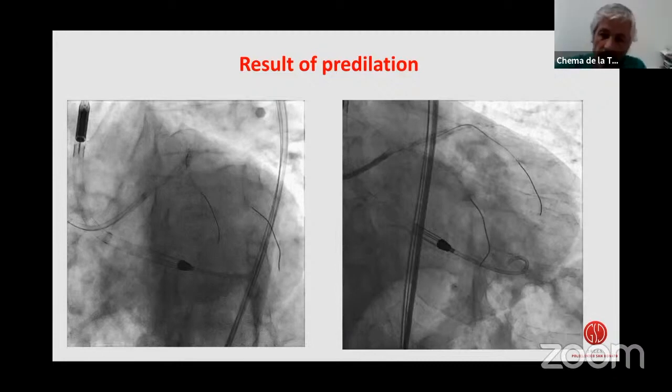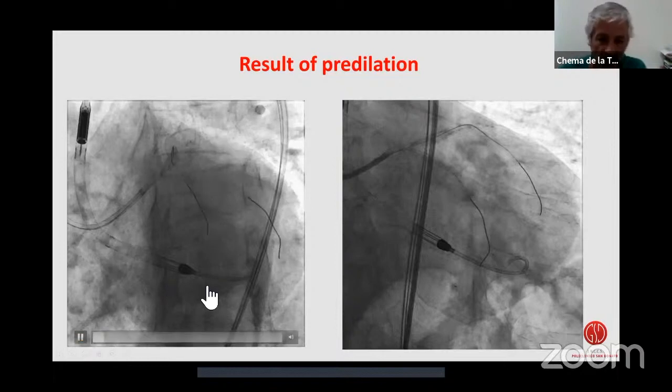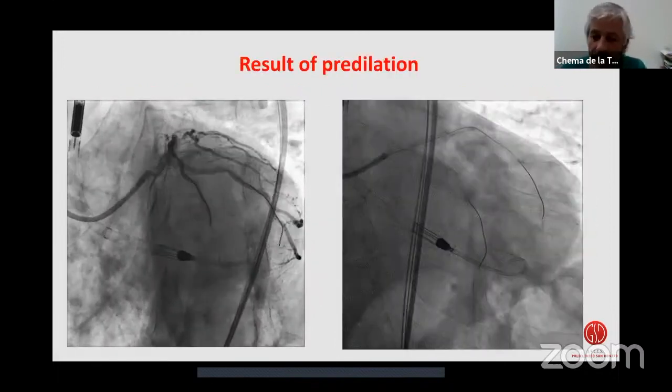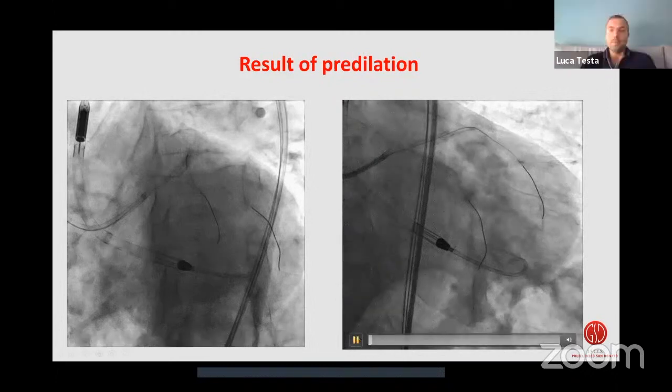Yeah, I think the LAD is pre-dilated, then the ostium has been touched. And now you could do IVUS because you have pre-dilated the lesions, and you have a space to see if the calcification is really worthy of some plaque preparation. You have the Impella, and maybe the patient is more tolerant to a shockwave balloon, for example. But anyway, it's important to have the hemodynamic stability and now to do the plan in calmer conditions.